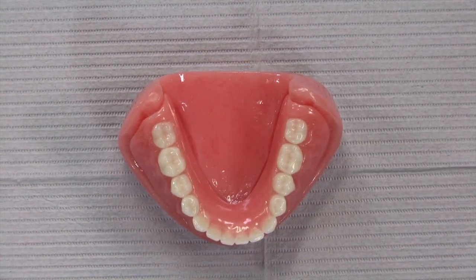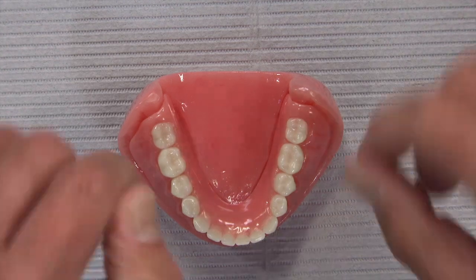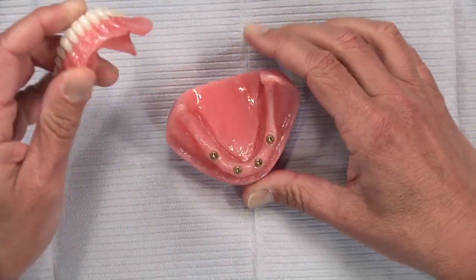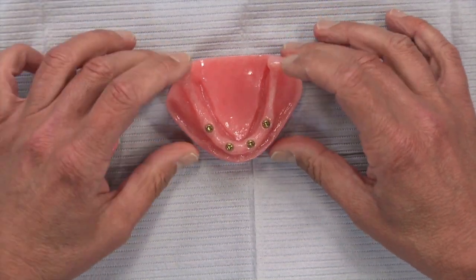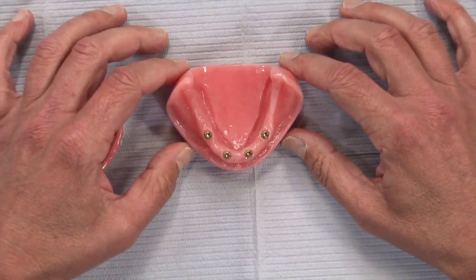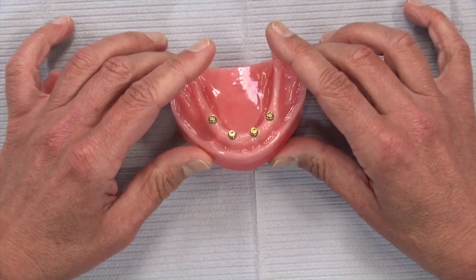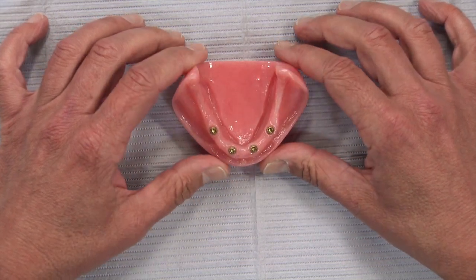Today's case of the week is a request: a doctor wrote in asking how to go over the steps for placing a removable lower denture attached to implants with Zest attachments — or locator attachments as they're more commonly known. This happens to be a full lower denture, and as I take it off you can see the four locator abutments in place. Even with a fair amount of ridge height, a lower denture without support often won't work, so placing locator abutments on top of implants is an excellent way to get additional retention.